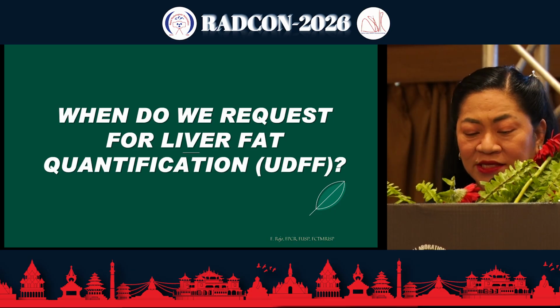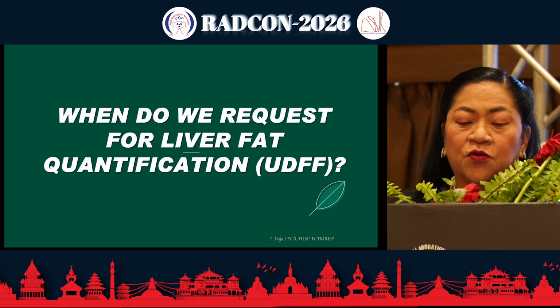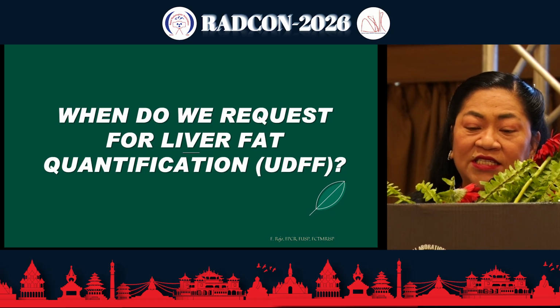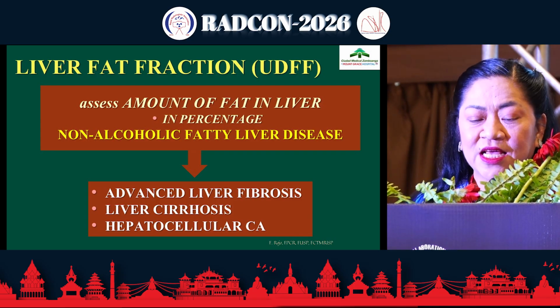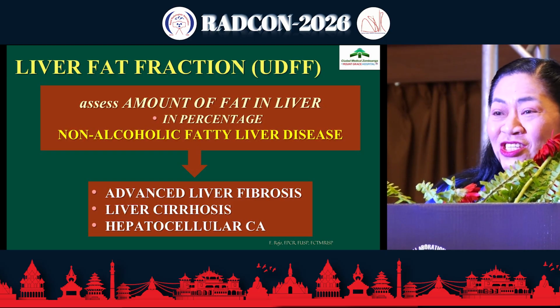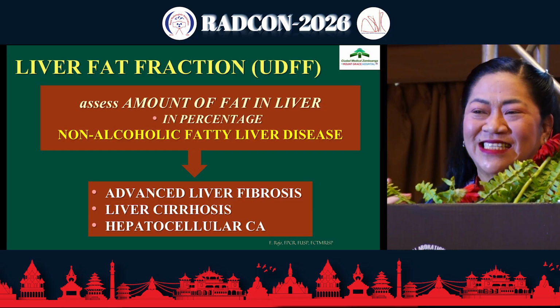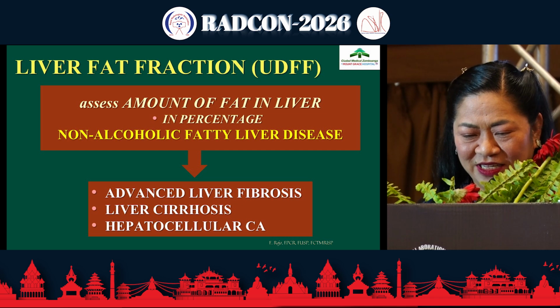So when do we request for liver fat quantification? We also request for liver fat quantification because we're thinking of non-alcoholic fatty liver disease, wherein it would lead to advanced liver fibrosis, liver cirrhosis, and hepatocellular CA. And hopefully ultrasound will also be useful for the fat quantification. It is said to be similar already to MR-PDFF.